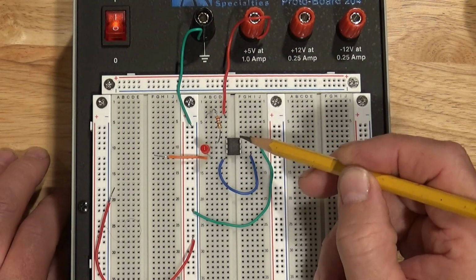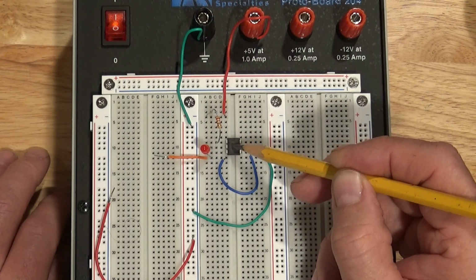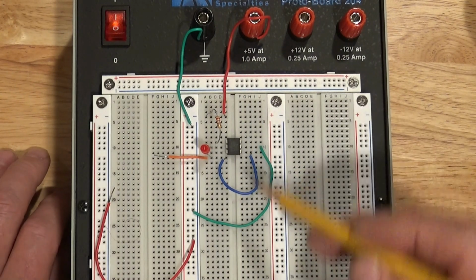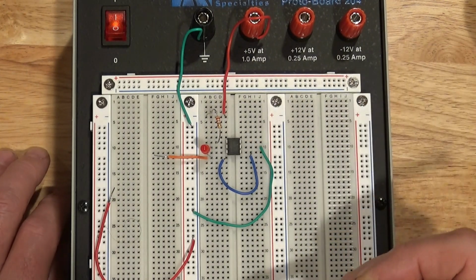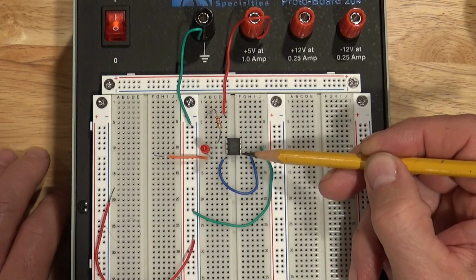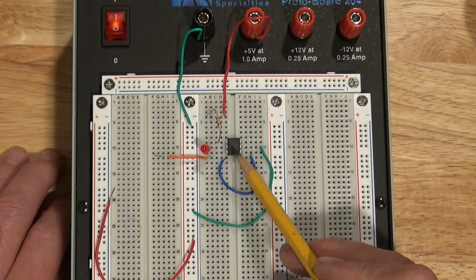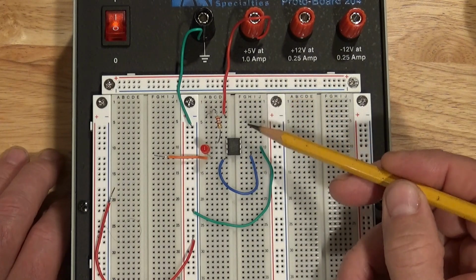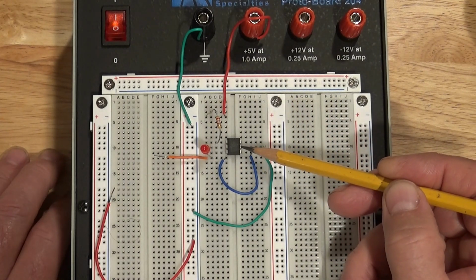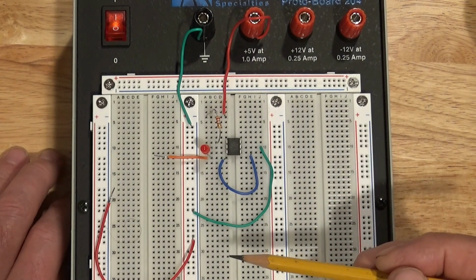And what's internal here, on this side of the chip, pins 1 and 2, that's an internal LED inside there, the anode and cathode. And on this half of the chip is the power side, the power handling, pins 4, 5, and 6. And the way this chip works is when the LED is activated and conducting, it makes pin 5 electrically connected to pins 4 and 6 simultaneously.